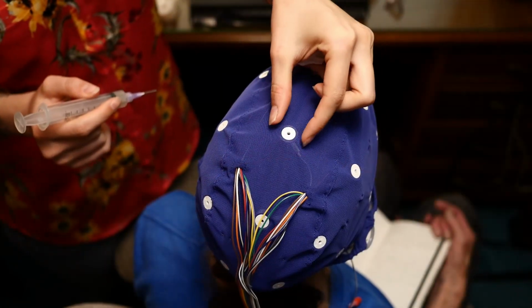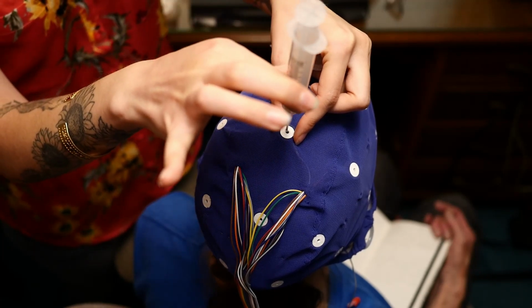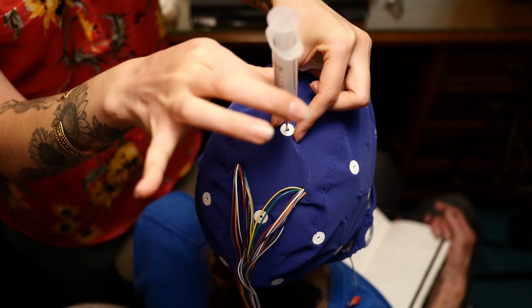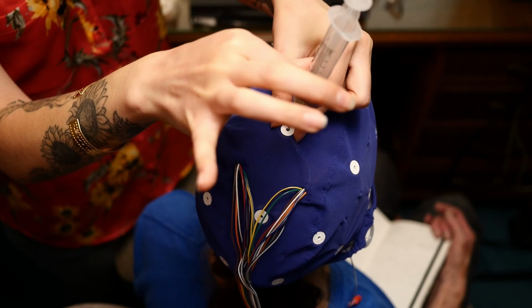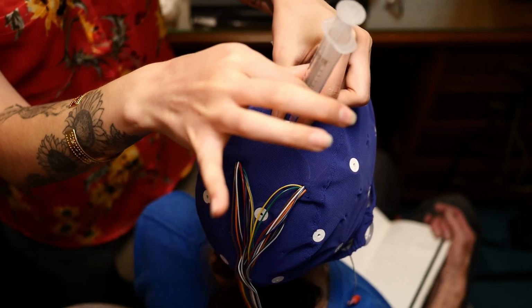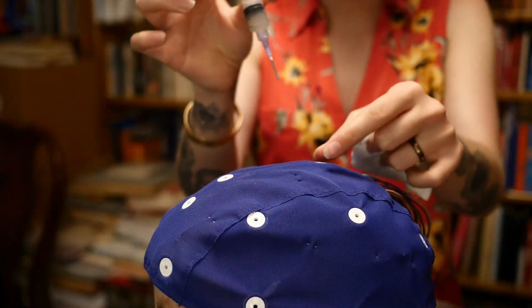Here we grab, and with either a syringe or a dowel, we are going to press ever so gently down onto the scalp. This pressing motion should not be uncomfortable for the client. It is not a thump, it is a tap. It is meant to push gel into the hair and distribute it accurately throughout the electrode.